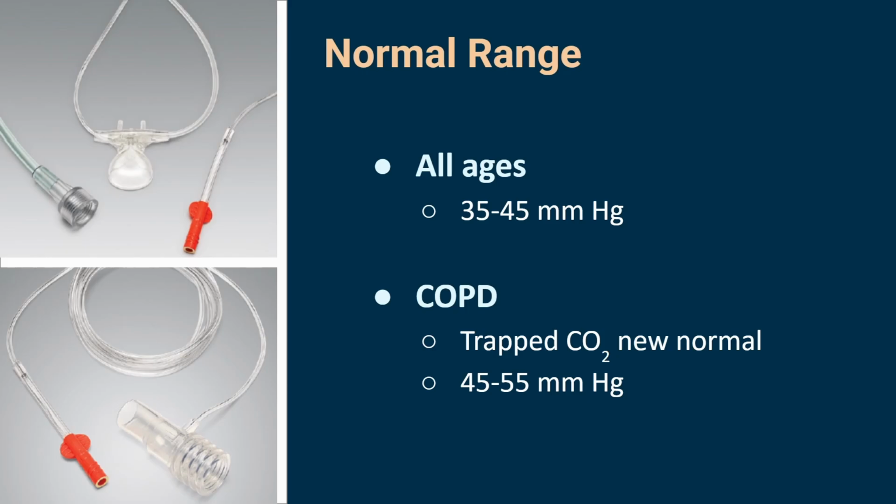But if you spent the majority of your time here just saying, I just use end tidal to make sure it's bronchospasm, I'm like, okay, that is probably better than the endless amount of times people say, okay, well, hypercapnic, and then if he retains, and then there's that trapping or whatever, and I'm like, yo, he is bleeding to death. Will you please put your hand on that wound? So don't get so hyper-focused on the possibilities and meanings of this. We'll talk later about the two most common assumptions made about end tidal.